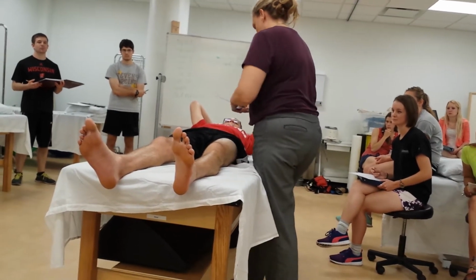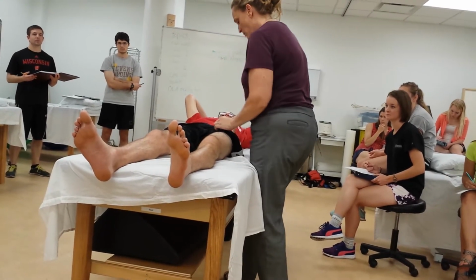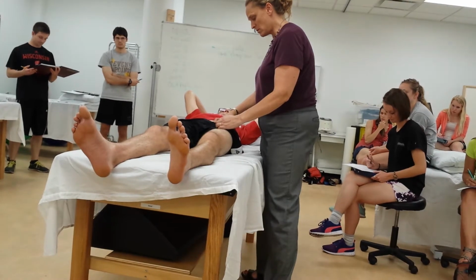There you go. And we're going to bisect the femur again. All right?